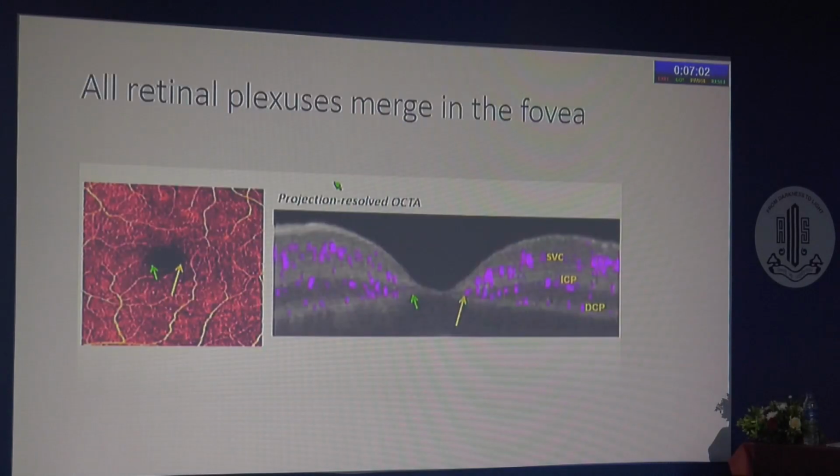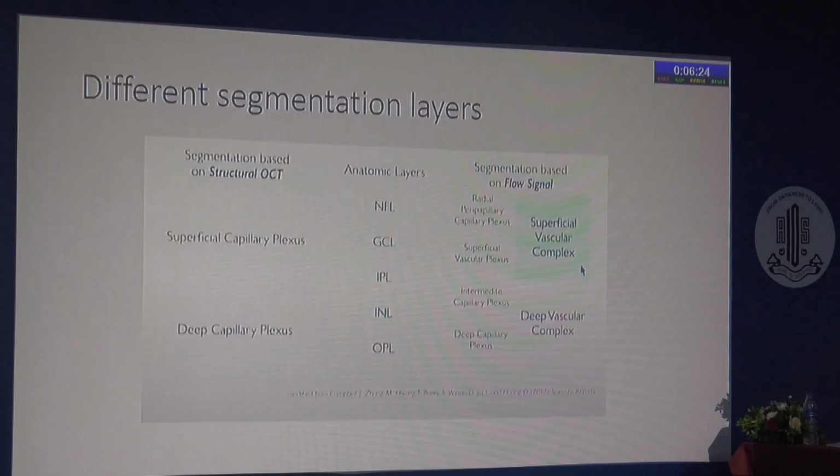Normally we have 3 layers: superficial, deep and intermediate, but the majority of OCT angios just show the superficial and the deep layers. What we have learned from OCTA is that infarct of each layer can cause a different problem. If you have an artery, you have arterial occlusion, or venous occlusion, but if there is a capillary occlusion of the superficial nerve fiber layer, it will be a soft exudate. You can have PAMM, and there are 3-4 terminologies for infarct of each layer. You see a whitish patch and the OCT angio will tell you which layer is getting affected. I'll show you the details.